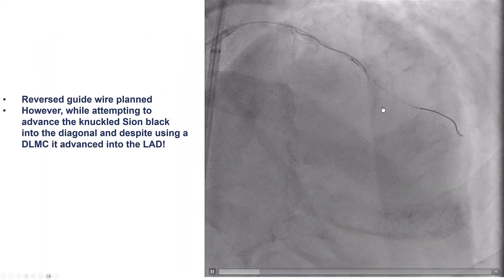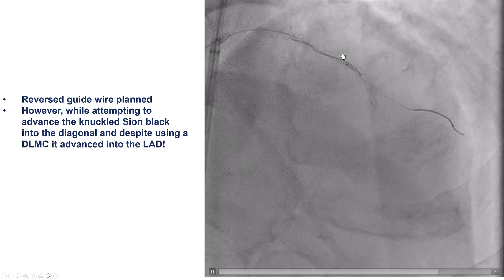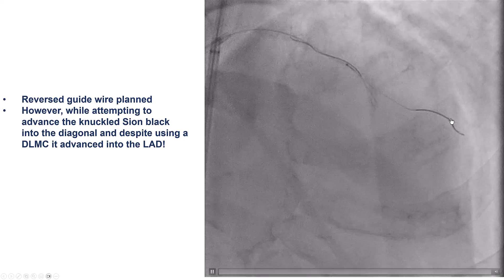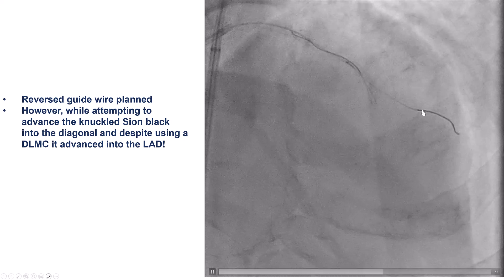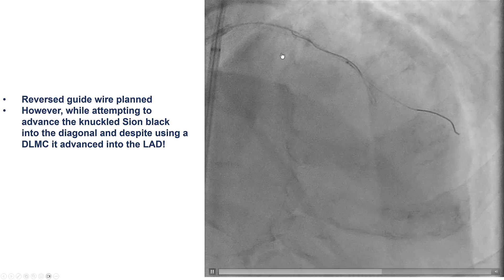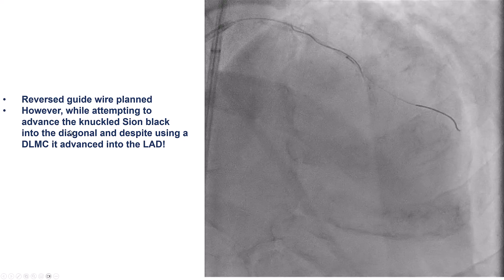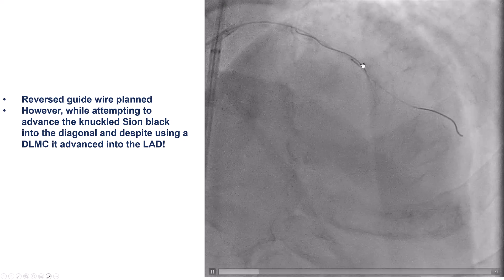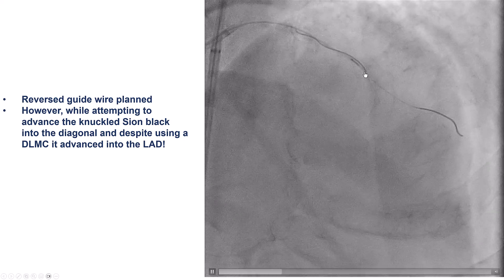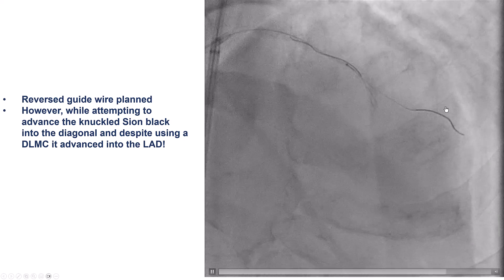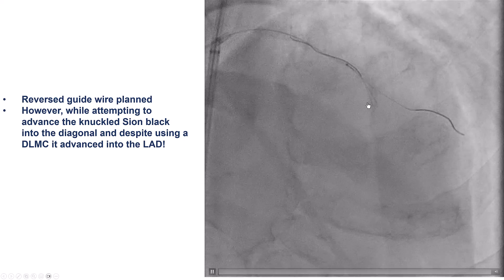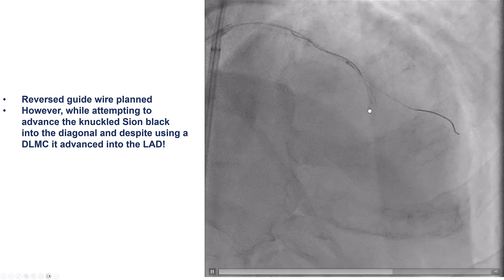Our plan was to start by treating the LAD. We advanced the workhorse wire in the diagonal, and then we planned to do wiring using the reverse guide wire technique. We used a dual-lumen microcatheter. However, instead of the knuckle going in the diagonal as we had planned, the knuckle kept on entering into the LAD.